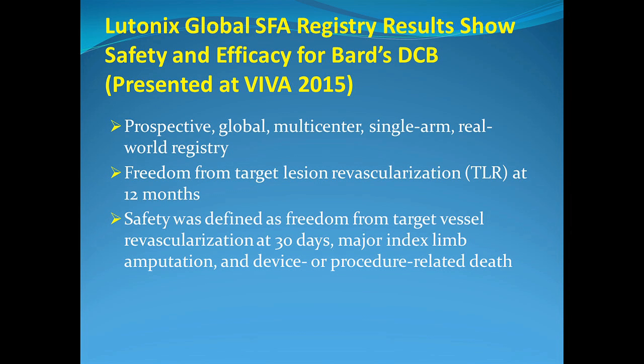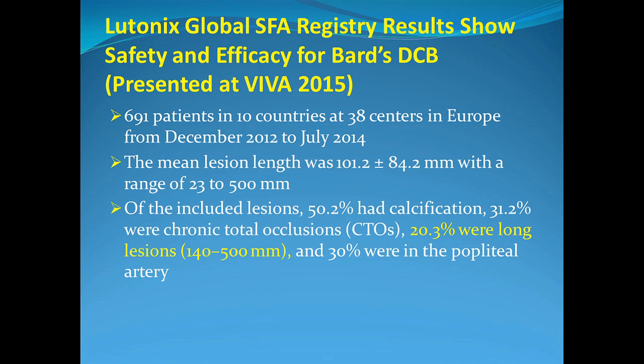And this is the other study of Lutonix, the other drug coated balloon from BARD, which was presented at VIVA again last year. It is not peer reviewed, not published. It is a prospective global multi-center single arm registry. This is from Europe, involving 10 countries, 38 centers, 691 patients.